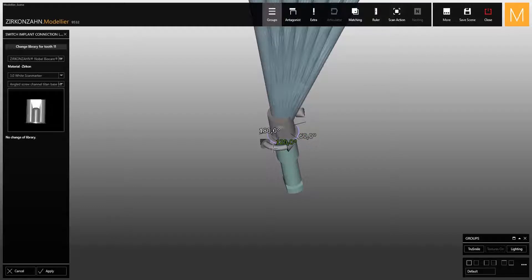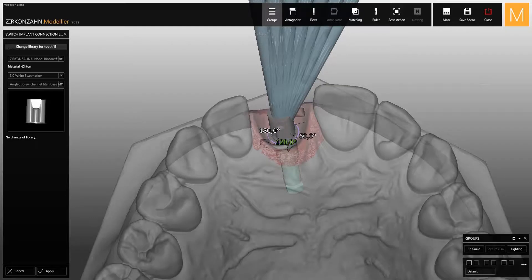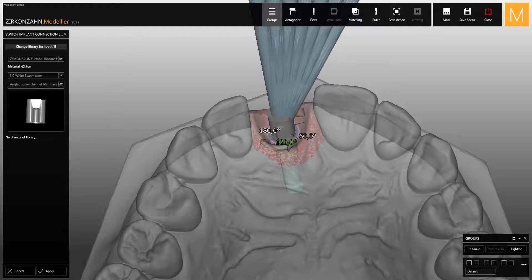In this case you can rotate the titanium base with a minimum movement of 60 degrees. While rotating the components, the degree of rotation appears in green. To determine the final position of the titanium base, click on apply.